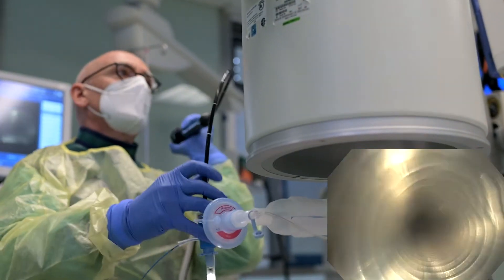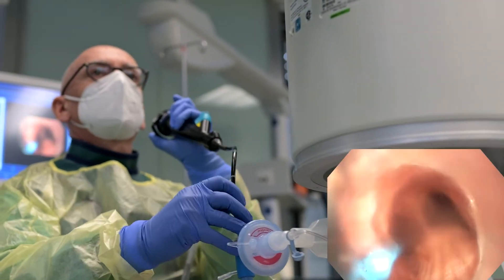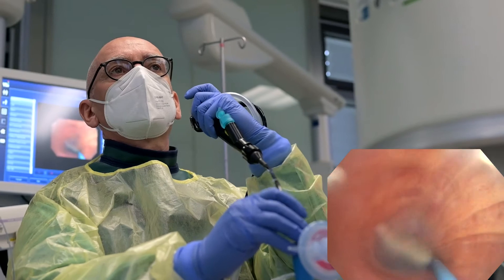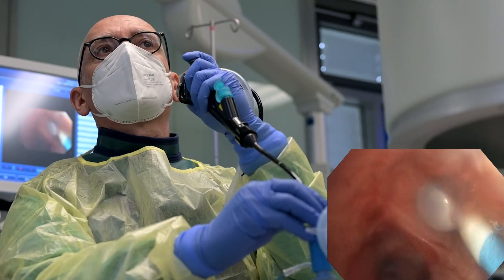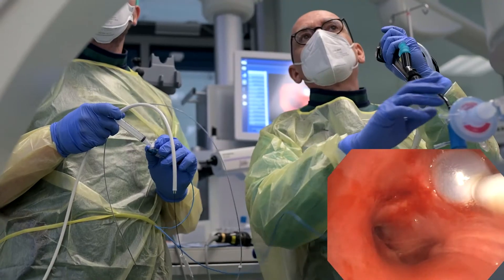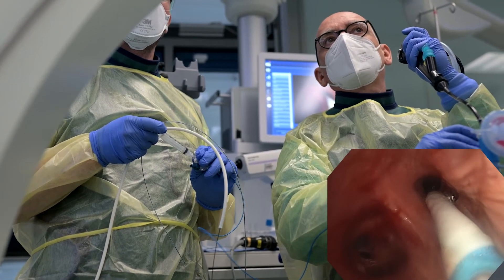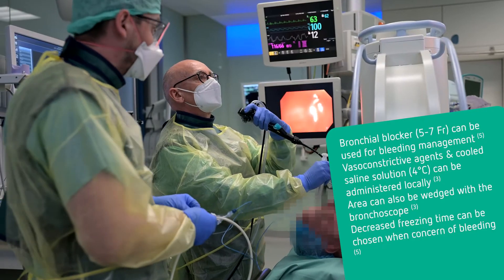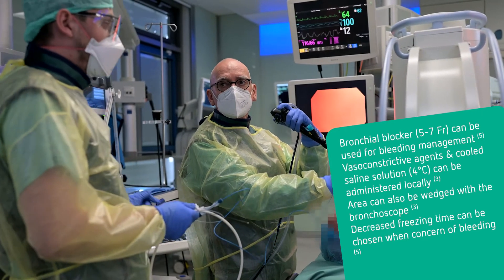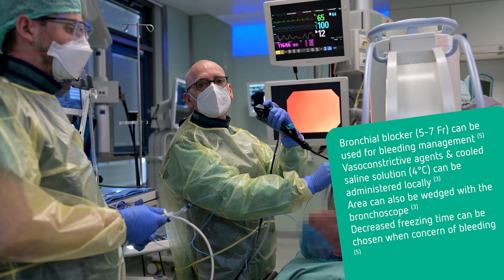The bronchoscope is reinserted through the ET tube and advanced proximal to the balloon. Following slow deflation, blood can be evacuated using the suction of the bronchoscope in the event of mild bleeding. Wedging technique and injection of ice-cold saline are able to control moderate bleeding. Only severe bleeding that can cause hemodynamic instability would require interventions that exceed the possibilities of bronchoscopic control.